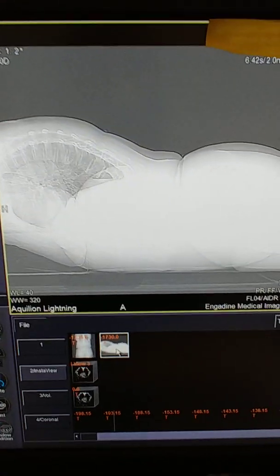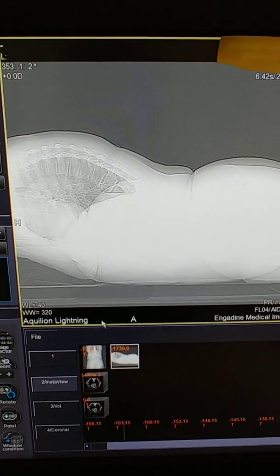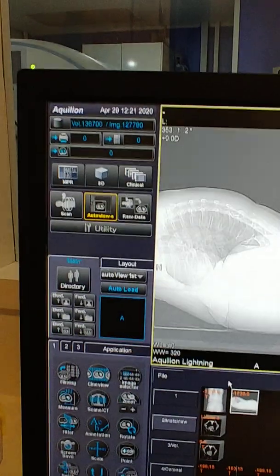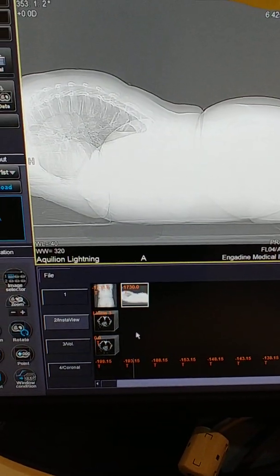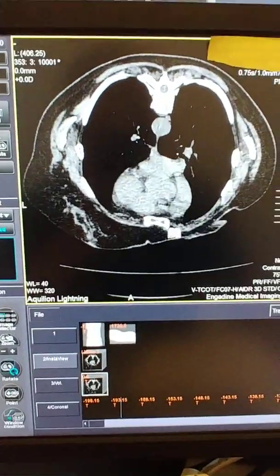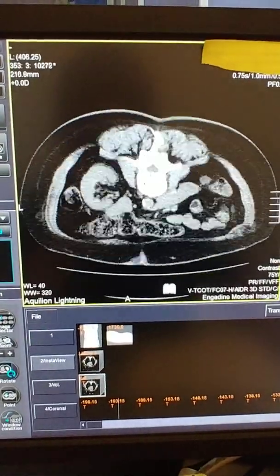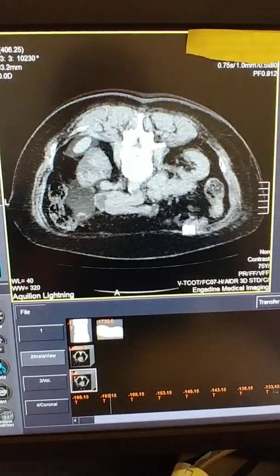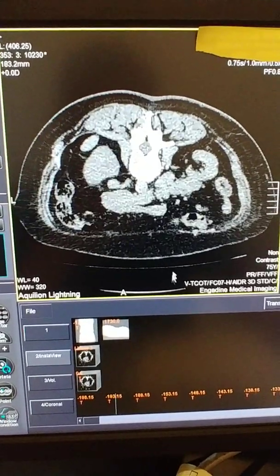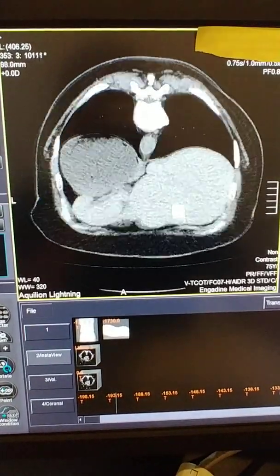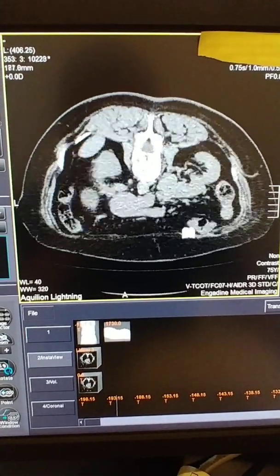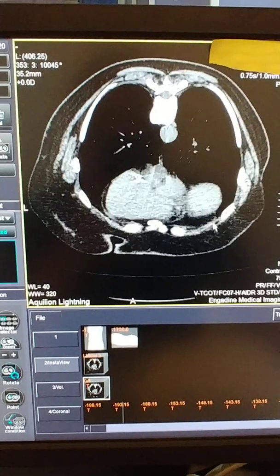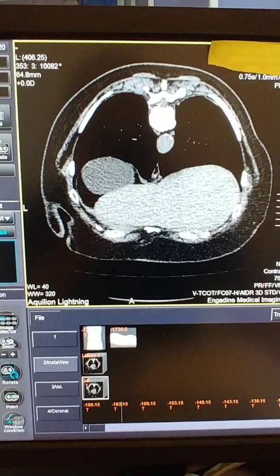We've done a KUB on this patient with the prone position, and when we scanned, the volume was made with this prone position still showing in the volume image. Our doctor wanted this thin volume image to be flipped.